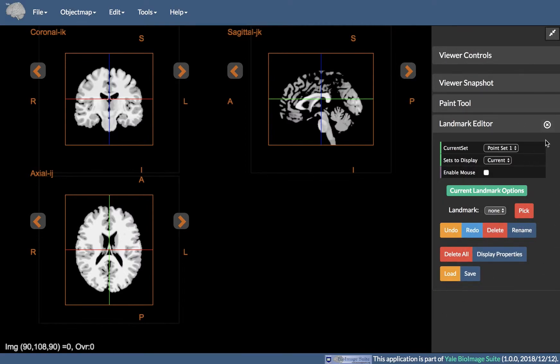By default, if no image data is loaded in the viewer, the Landmark Editor tools will be empty.